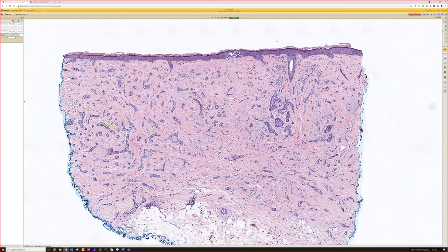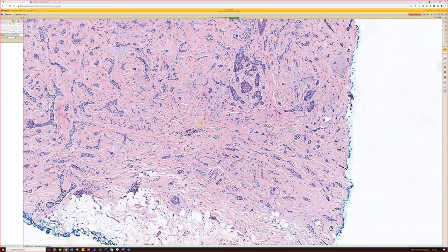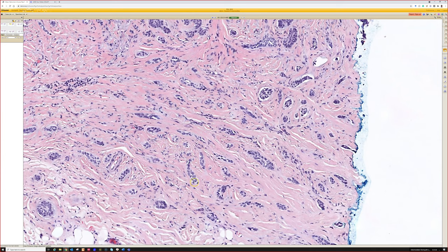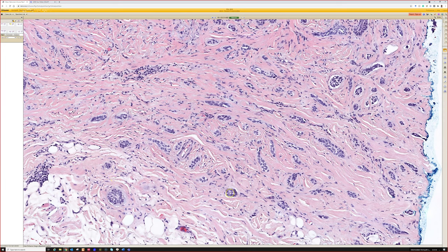For one thing, look at how densely sclerotic the dermis is, just like morphea, right? And you can imagine that this would look like a firm, depressed, whitish plaque on the patient's skin because their dermis is like a solid rock of dense collagen. And in that dense sclerotic stroma, sometimes it's more cellular than this too, are these tiny little basaloid strands of basal cell carcinoma that are just two or three cells thick, and they're stranding out in between. So yeah, if you just had an area like this, you could wonder, is it desmoplastic trichoepithelioma?